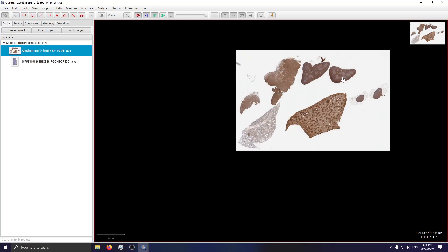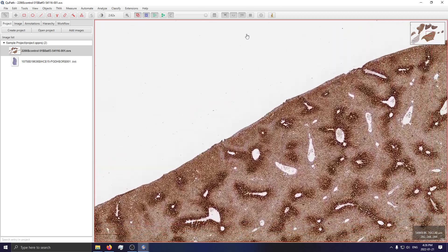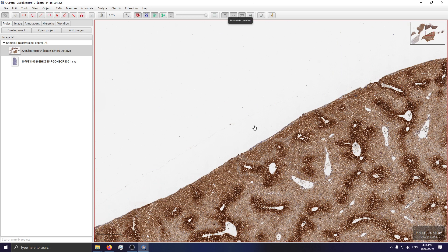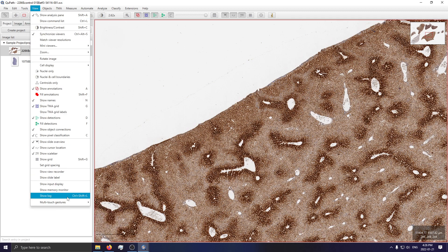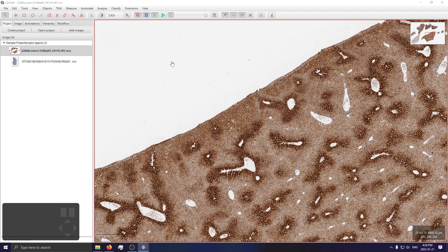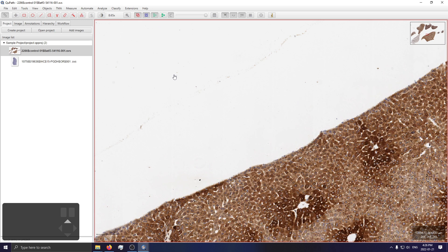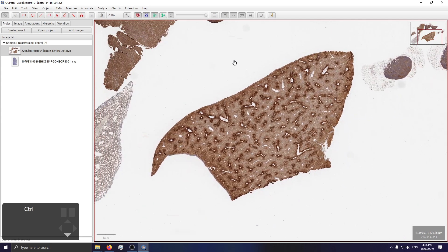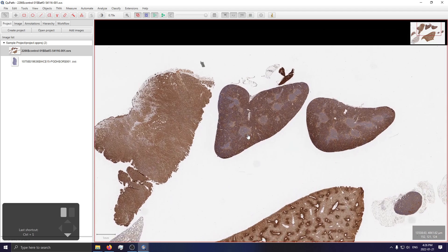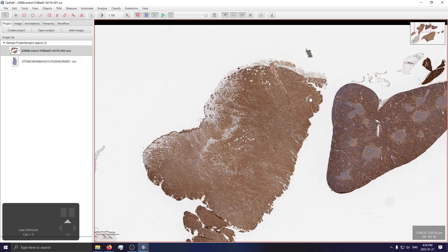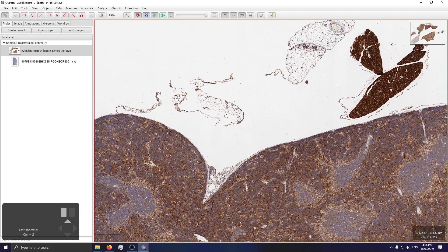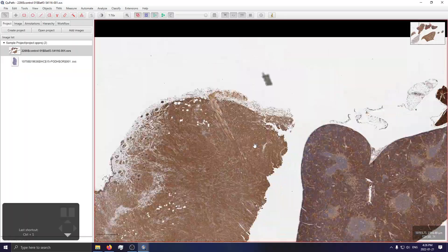There are a couple of things shown on screen in addition to our image. We have a little thumbnail which shows the macroscopic view if we're ever zoomed in — if we want to disable that, just click this button. I'm going to enable something called Input Display, which will show any left or right clicks, scrolling, or shortcuts like Ctrl+S that I press — you don't have to do this, but it helps for the video. You can use the scroll button to zoom in or out, and drag to pan around.